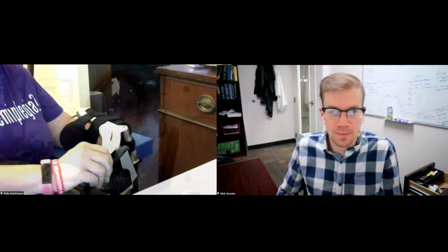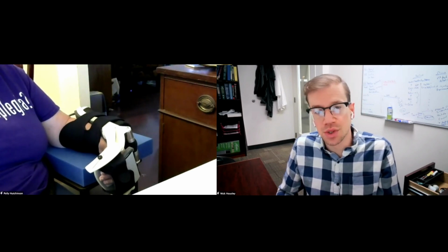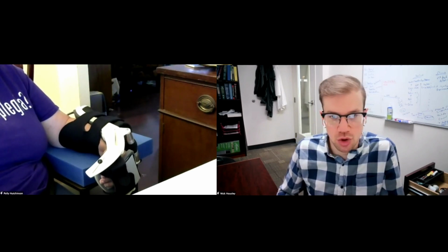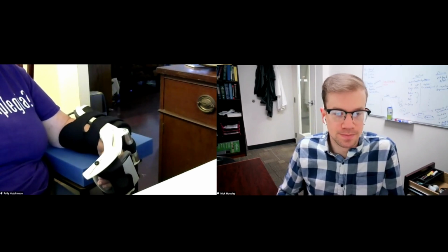Now, I want to do a 3-step evaluation process here, and we can figure out our starting values, and these will be our ground truth for how we progress going forward. Okay. So, I thought this might be helpful. Oh, great. Yeah, that's great. I like how you're also using it in more of that supinated position. That's totally fine. So pretty happy with that as well. That was another one of my questions.